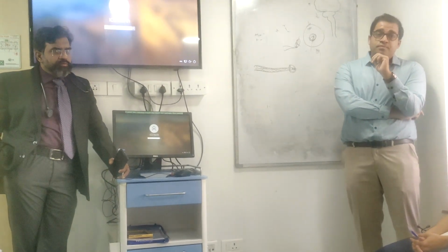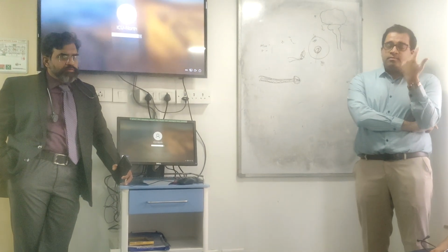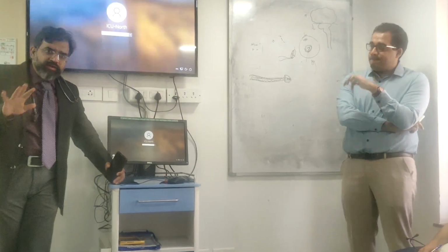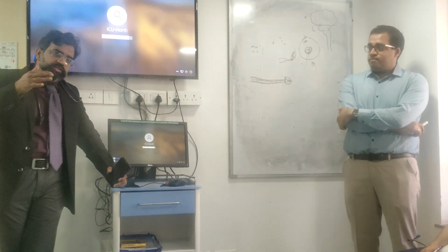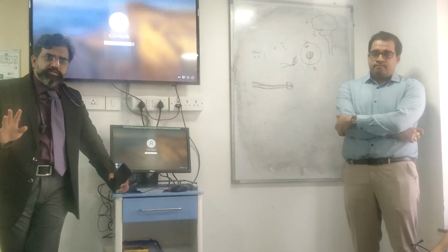If you are getting both the bottles, one from a fresh peripheral line and one from another site, ideally 2 sets have to go. You can't send 1 set. 1 set will actually reduce your sensitivity, so you really can't do that. You have to always send 2 sets.